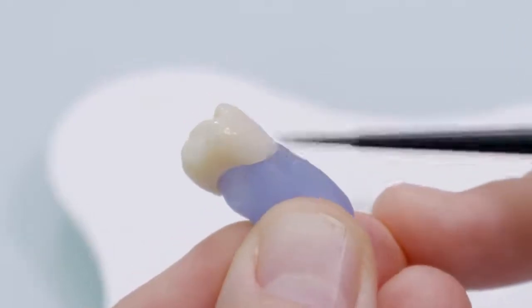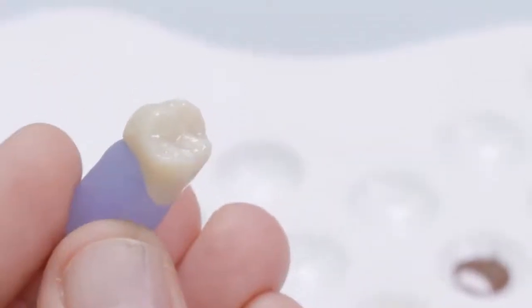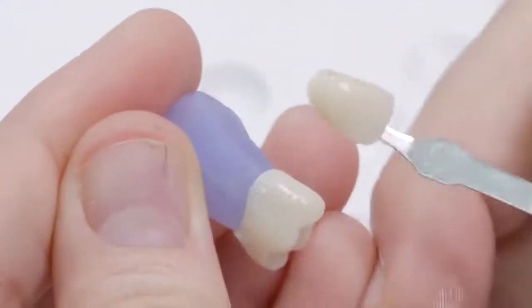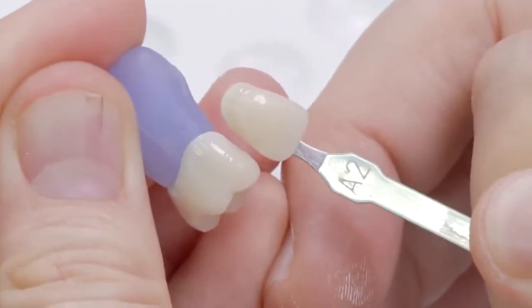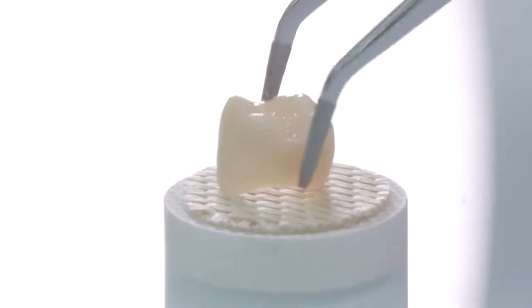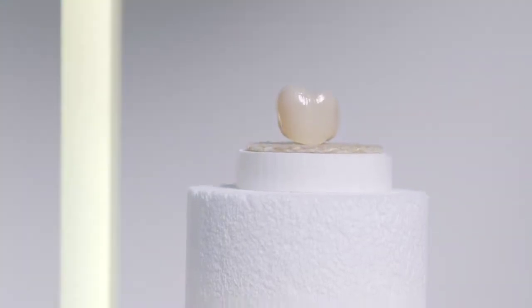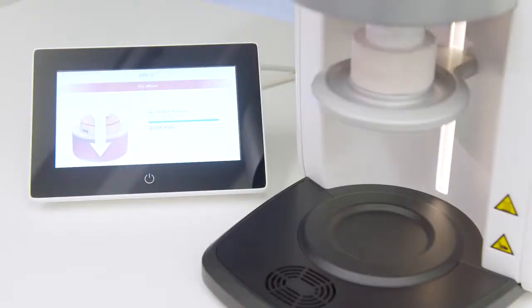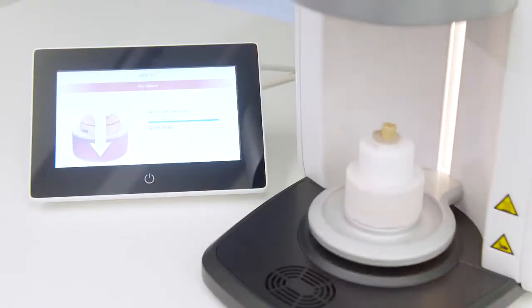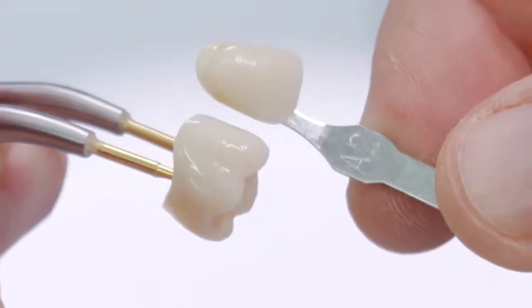The Dentsply Sirona Universal Glaze pastes are wetted with a few drops of stain liquid and brought to a viscous consistency by stirring. The glaze paste can be homogeneously applied on the crown surface. The crown is then placed either on an investment pin or the firing fleece on the honeycomb tray and fired in the preheated Cerec Speedfire using the appropriate firing program. An aesthetic result can be achieved in this variant with quick and simple working steps.